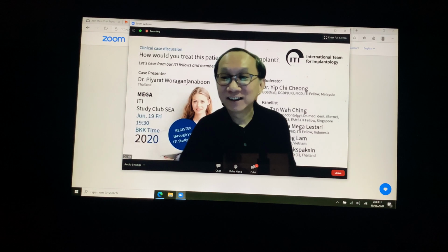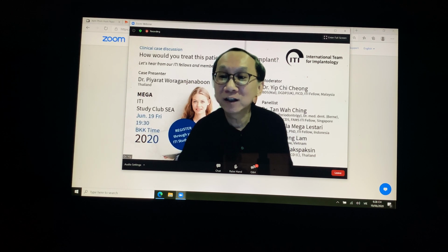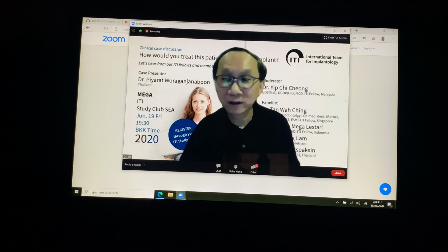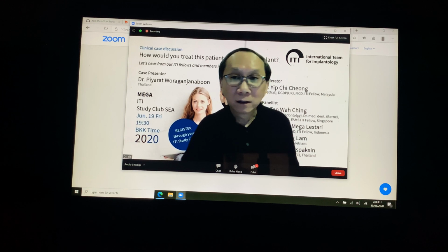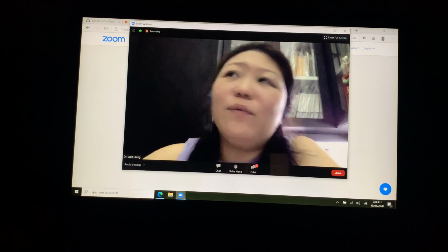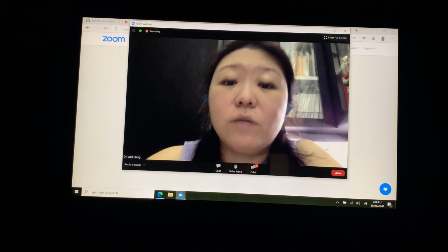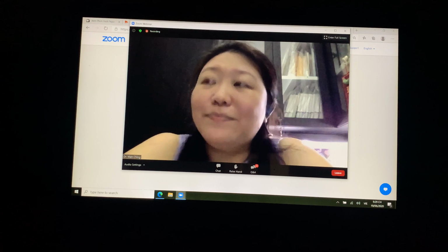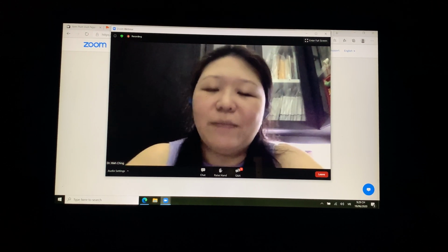We have a participant who posted that Ethos is an alloplastic material, beta TCP with calcium sulfate. I think the calcium sulfate binds the alloplastic material together. Well, there is not enough experience to be shared in this forum. But if you look at one of the studies by Rona Yong, though it may not be the same brand, also beta TCP, it shows that it actually has more resorption. Yes, I agree. Beta TCP is gone very quick. TCP is tricalcium phosphate. It's not the same product, but it's the same kind as beta TCP.